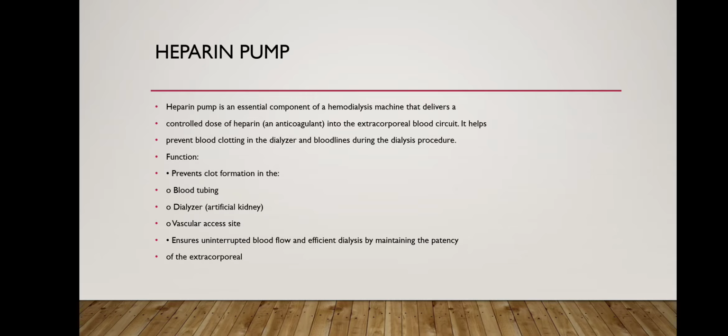The main function of the heparin pump is to prevent clot formation in the blood tubing, dialyzer or artificial kidney, and vascular access sites, and to ensure uninterrupted blood flow and efficient dialysis by maintaining patency of the extracorporeal circuit.